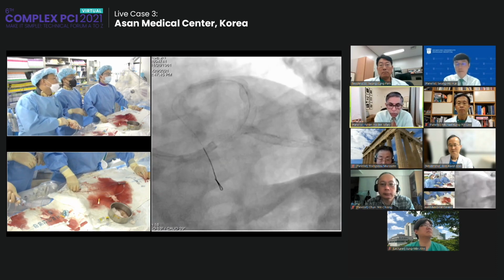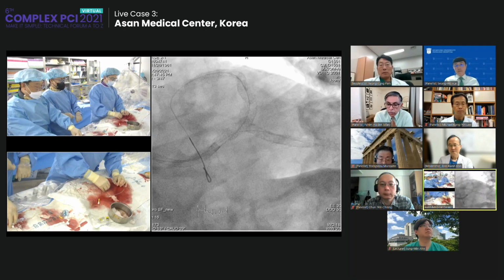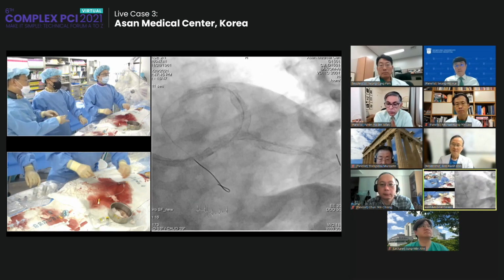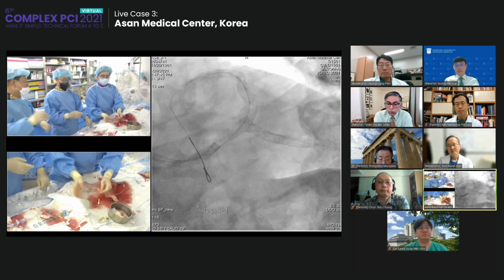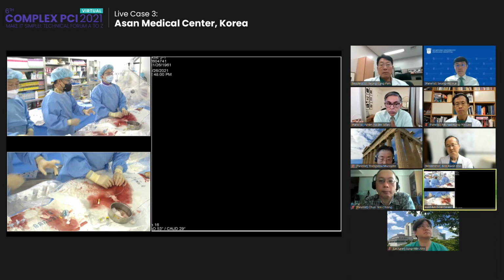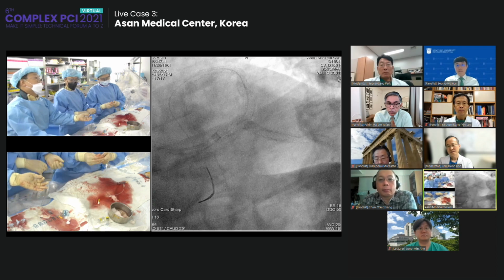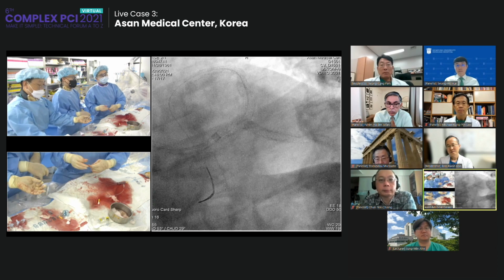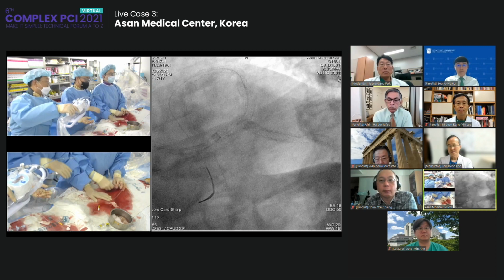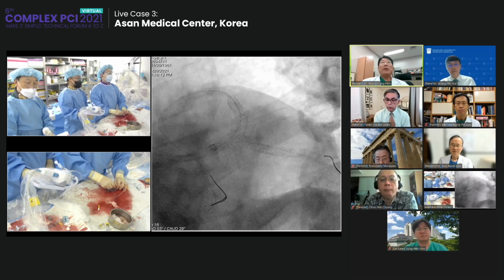Do you repeat the left main with a bigger balloon? Good. Oh, great. We don't usually do the re-POT. So, if you're going to check with IVUS, usually the lumen area is sufficient, and some expert consensus recommended it, but for the re-POT, we don't fully agree on the real practical impact of the re-POT. Would you do the IVUS again? Yes. Yes. Angiographically, I think it's perfect.